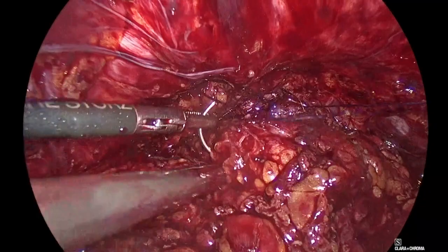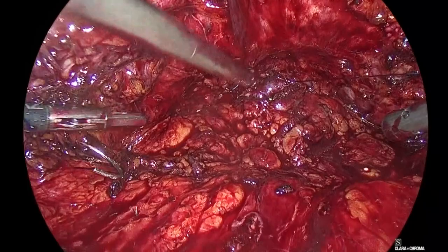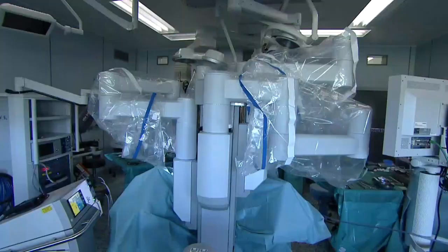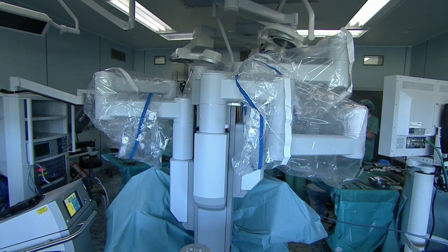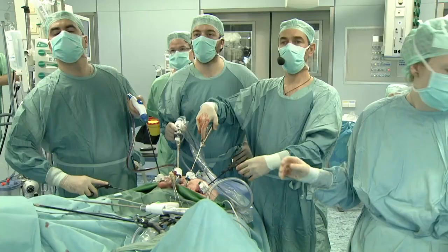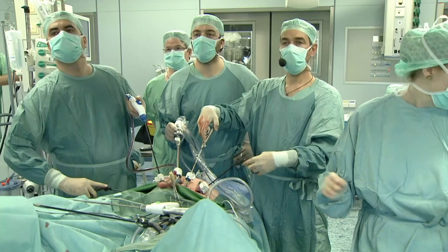Is it an inside-out stitch you are doing, actually? This is an inside-out stitch. This is my final stitch on this side. So you will see that this is how I reconstruct completely. Go back. Leave your suture, Panagiotis. Leave it. Show him on the right side. Come on top. Good. Get mine. Good. Give me a harmonic, please.